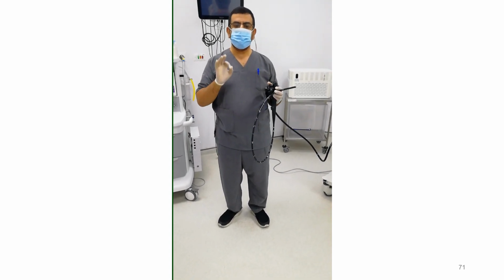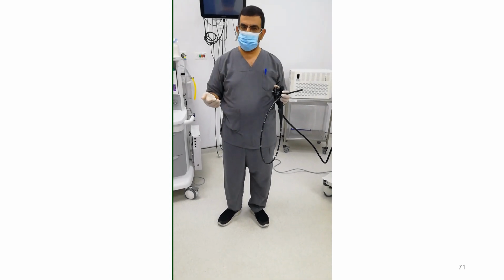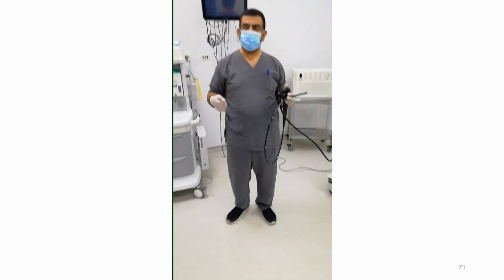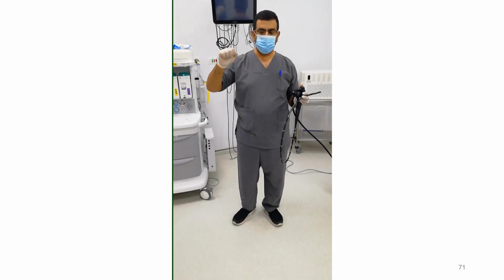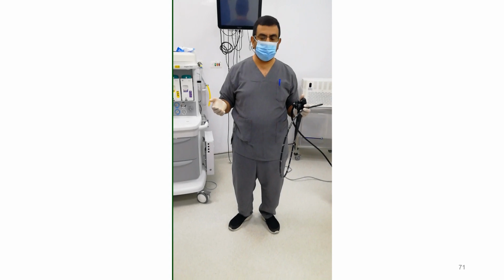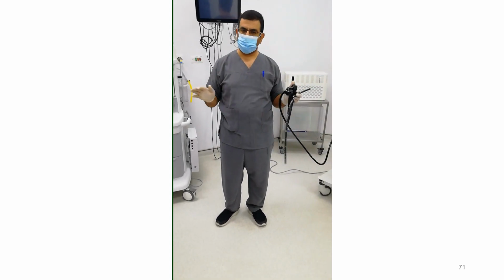الفلويد ده لازم تشفطه بالكامل وانت واقف. ليه بقى يا جماعة؟ كتير جدا من حضرتك بتعمل منظار تلاقي العيان بيرجع في المنظار كل شوية، عمال بيريت، عاوز يشد المنظار كل شوية، متهيج معاك. انت فاكر إنه متهيج عشان قلب المنظار؟ لا خالص.